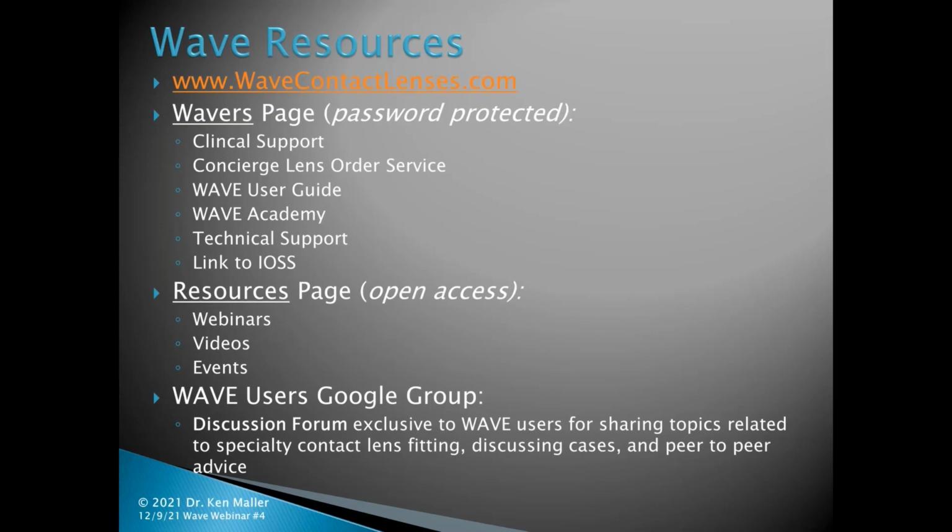Here's a very straightforward one. How do you determine your lens diameter? That is very straightforward, and it's very easy to answer too. New wearer, non-ortho K, typically around 0.5 smaller than the horizontal visible iris diameter. So if you have an 11.7 eye, I'd probably be right around 11.2 or so. So that is very, very straightforward.